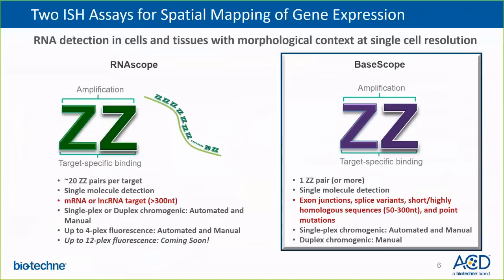The RNAscope technology consists of 2 unique assays to detect RNA in the tissue context at single molecule sensitivity with single-cell resolution.